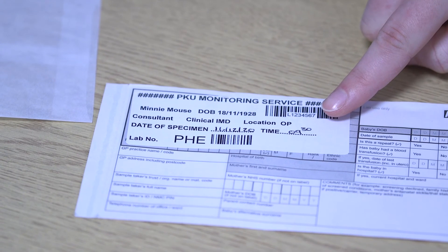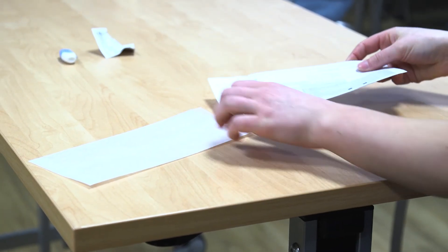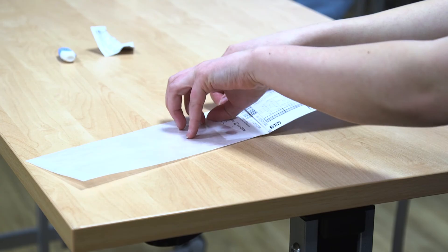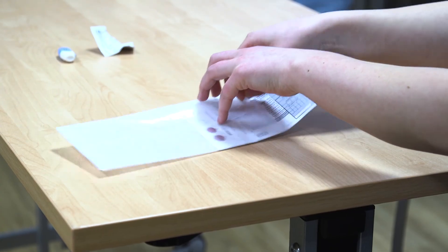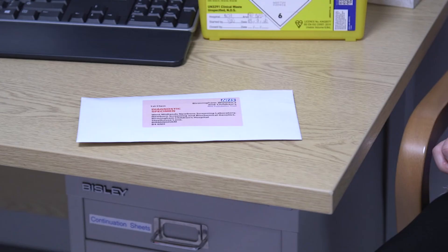Write the date and time on the blood spot card and then place it into the clear envelope. Place the spot end of the blood card into the clear envelope, not the other way around. This then goes into the self-addressed envelope to be posted. Please ensure you have a first-class stamp on the envelope so that it can reach our laboratory in a timely fashion.